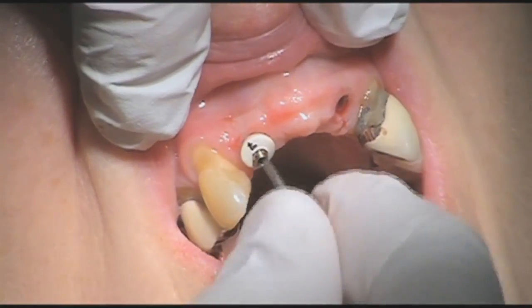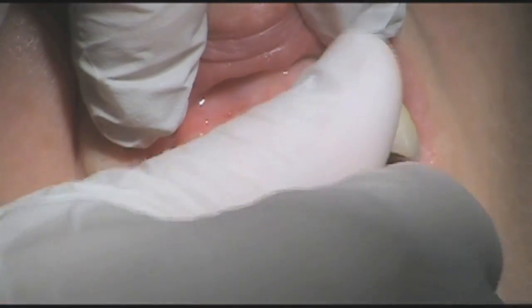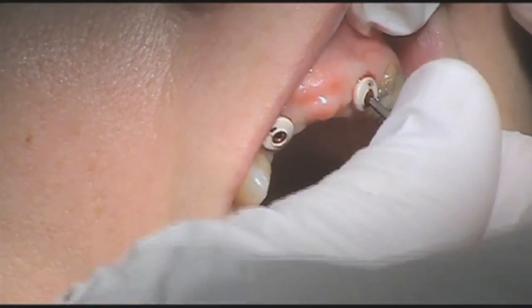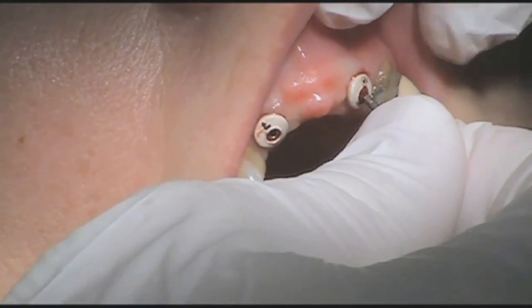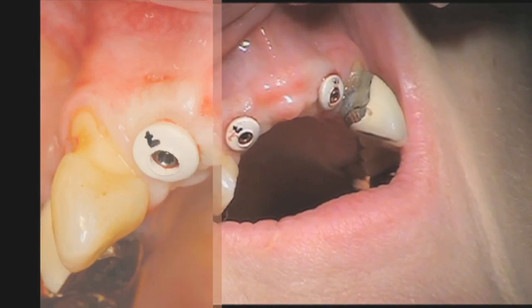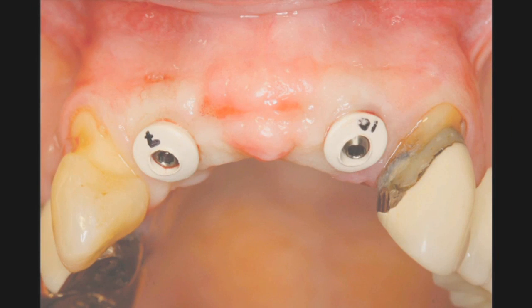We see that at the time of surgery, custom healing abutments are positioned into the implants. At this point, the patient's maxillary flipper appliance could be adjusted, could be relieved, and the implants and soft tissues allowed to heal conventionally, depending on your thought process and how you want to handle the case.